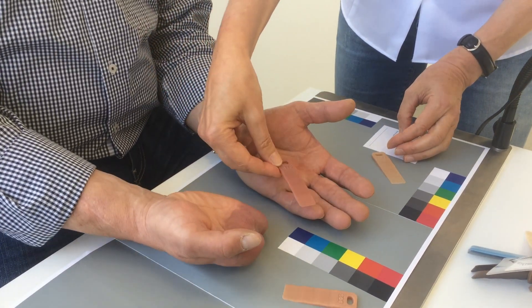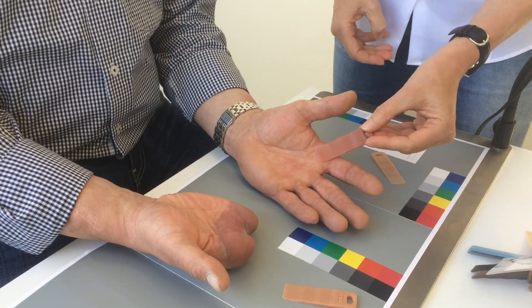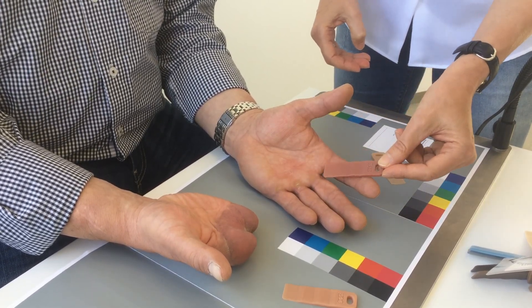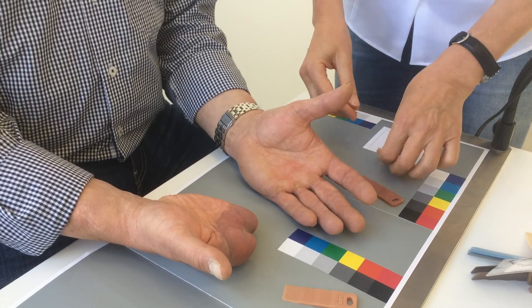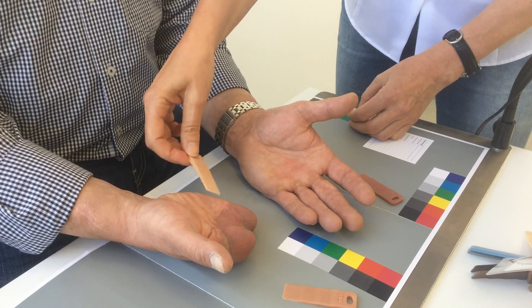Please turn your hands up. You can use the character color for the fingertips as well as for the palm of the hand. I have chosen a light tone for the palm — the third color.